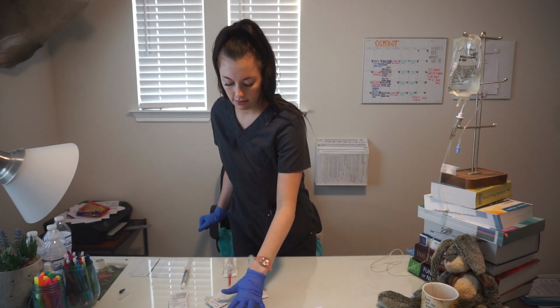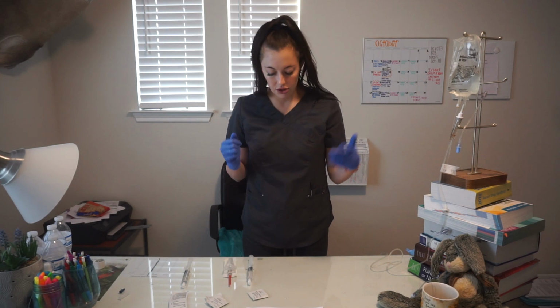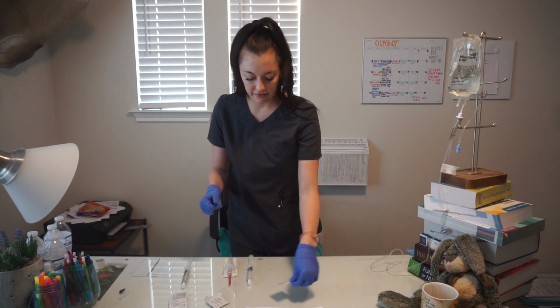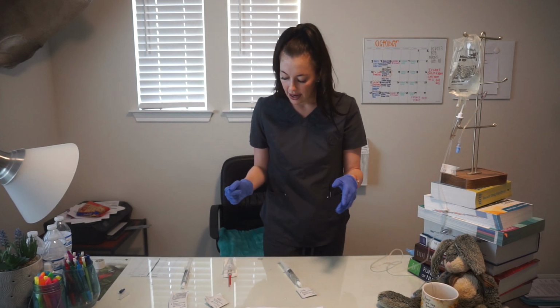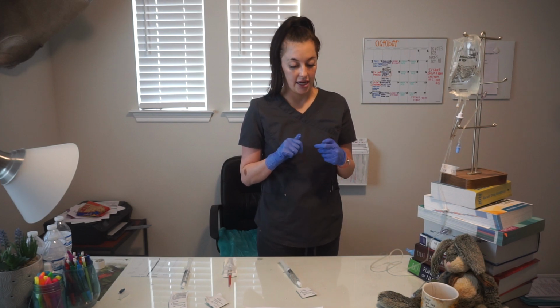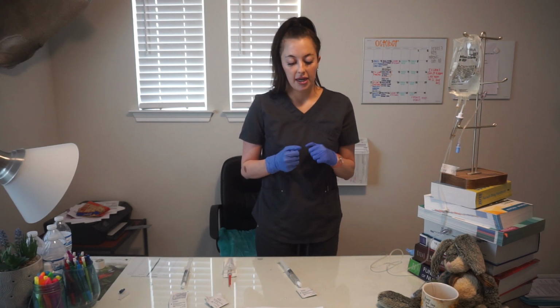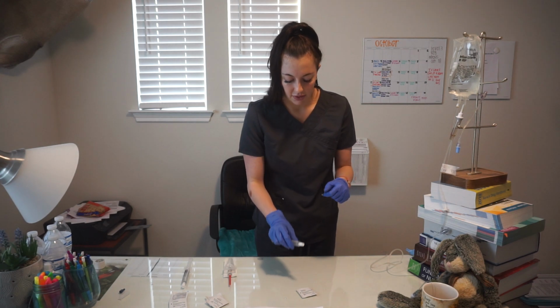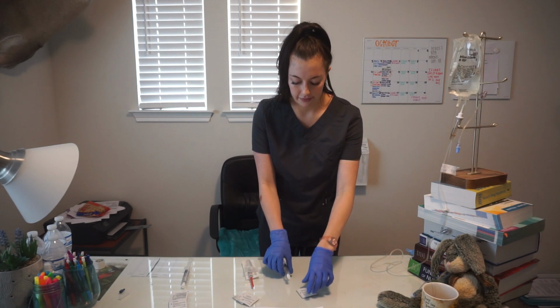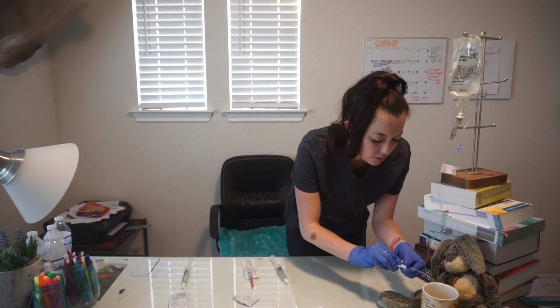Mr. Moore, I have your drugs for you. Like I said, I'm going to first start by aspirating and then flushing, but I have your labetalol, it's 4 ml of labetalol. It's going to help control your blood pressure. You might experience some dizziness or nausea, but I'll be back in to check on you. I'm going to push it over 2 minutes. But first, I'm going to clean your port for 15 seconds.